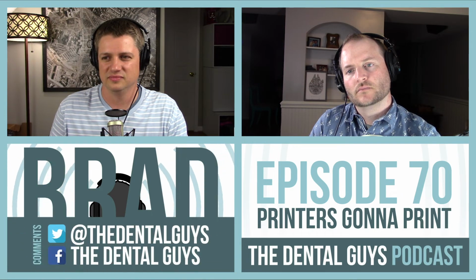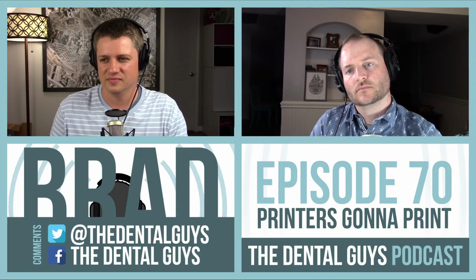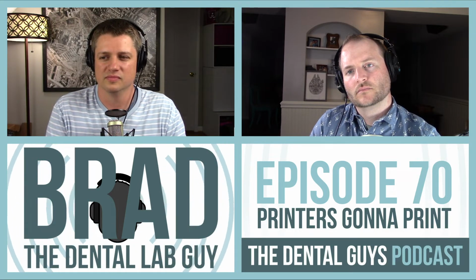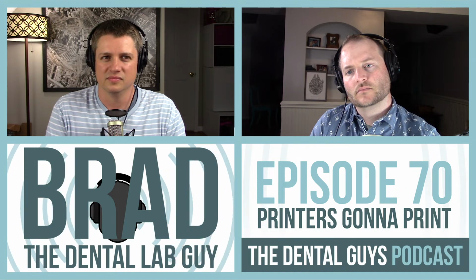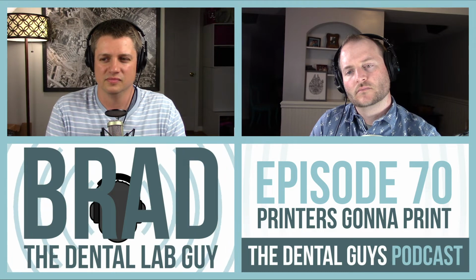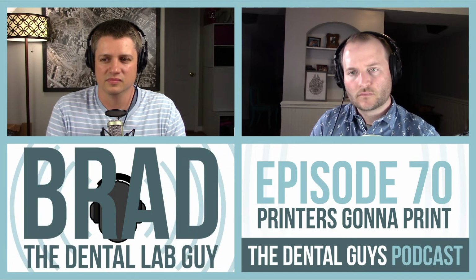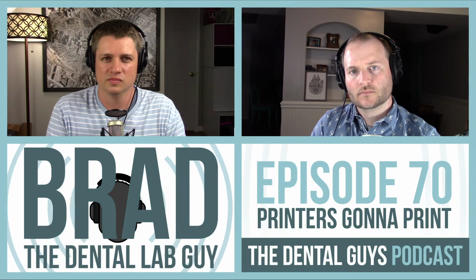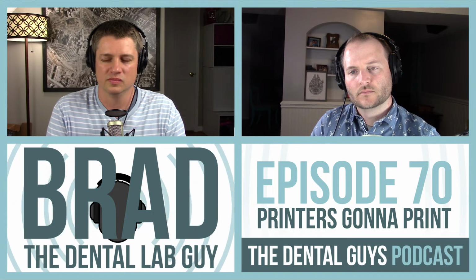It's just what you get to them. How you get the file, how you create the file. It's the software understanding that is more of the learning curve. You said the Meshmixer, the ExoCADs, the different software that you want to create different things with. That sort of learning curve comes in. The printers are actually pretty simple. Once you create a 3D artifact or a 3D dimension, you can put it to it. It does have some technique sensitivity when it comes to spruing, though.